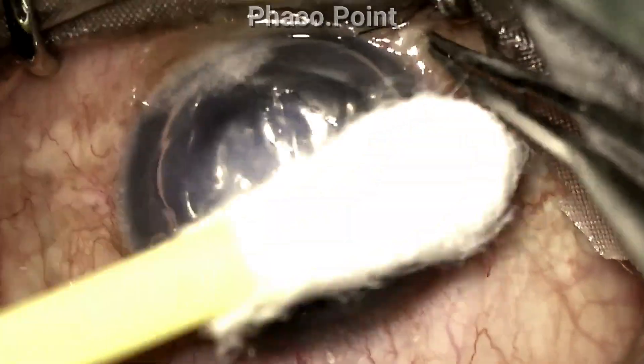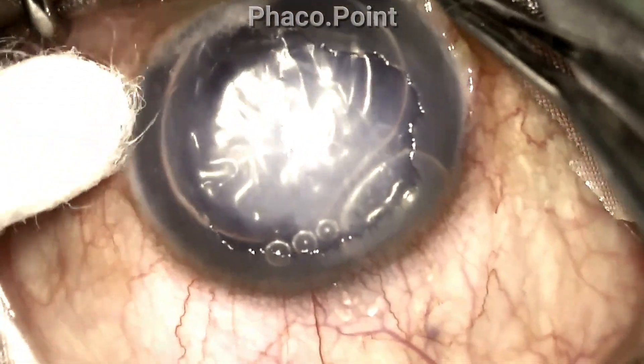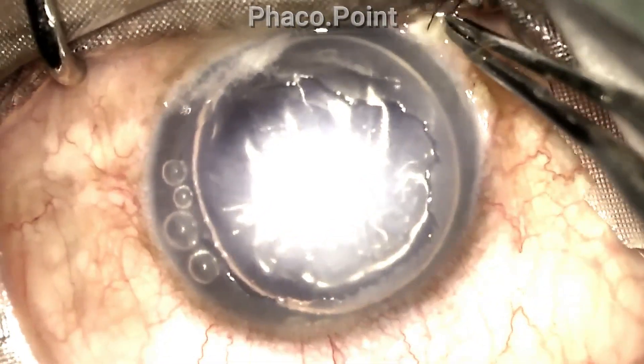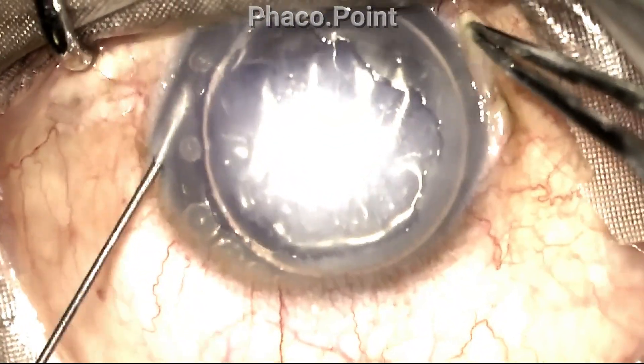What you look for after this is that as the air or gas settles the Descemet's, the cornea starts to clear. This is what we are trying to visualise in this part of the video. Please note that visualising the clearing of the cornea can take up to a few minutes.